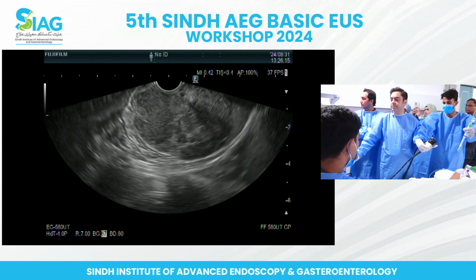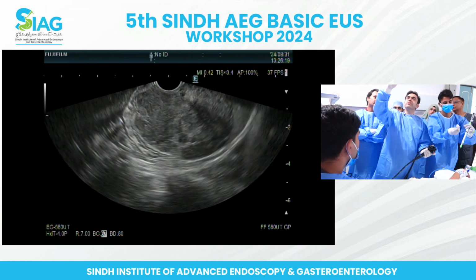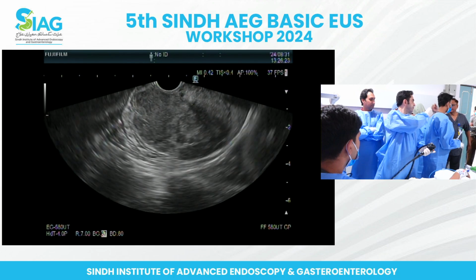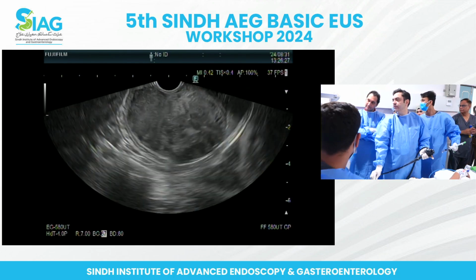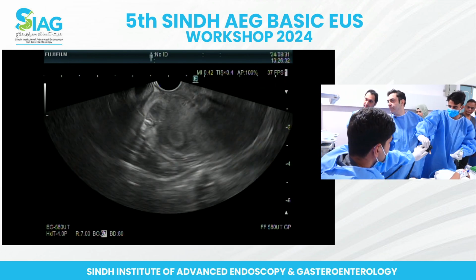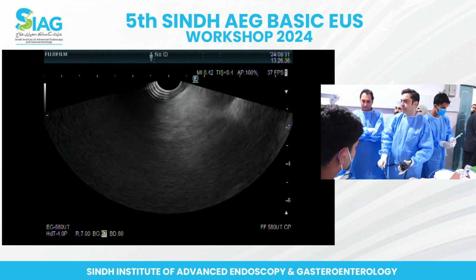Let's see what that shows. So the other thing here for candidates: if you look at this tumor, GIST, you see those black spots, that shows the areas of necrosis in there. So that's a component, just looking at it without even doing a FNA, of an aggressive GIST. These are the ones that bleed, they can spread.